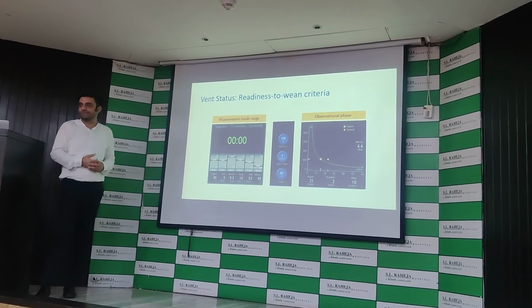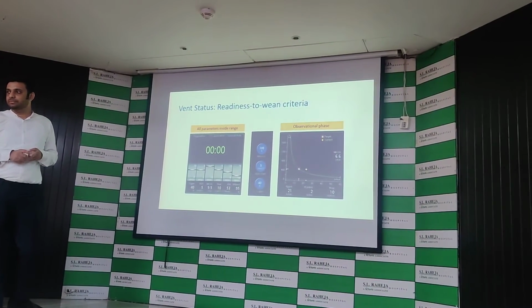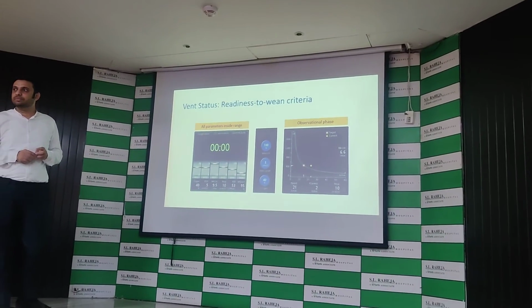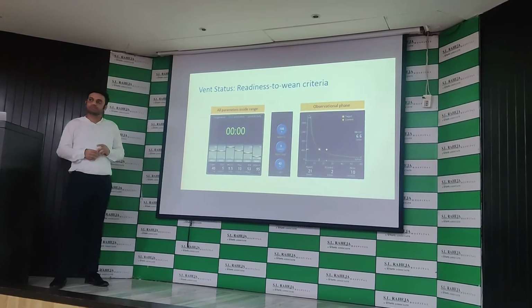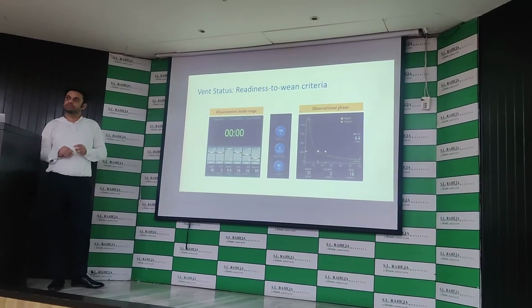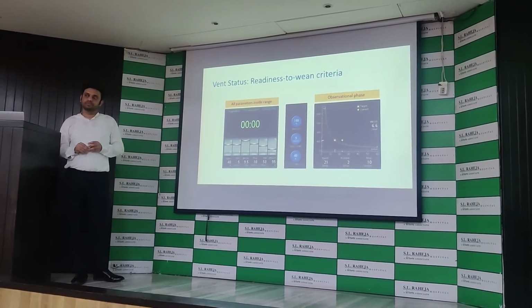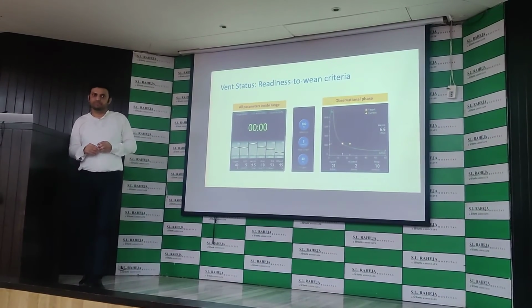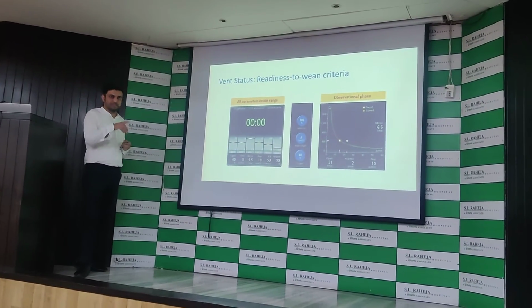You were asking something? Yesterday when we had a patient, it was going on for like 2 hours, no? The SBT timer just kept on going. They are saying that it will display a message. No, it will not show extubate. It will just keep on displaying 2 hours, 3 hours, 4 hours. That's what we know, unless you go on to an SBT.